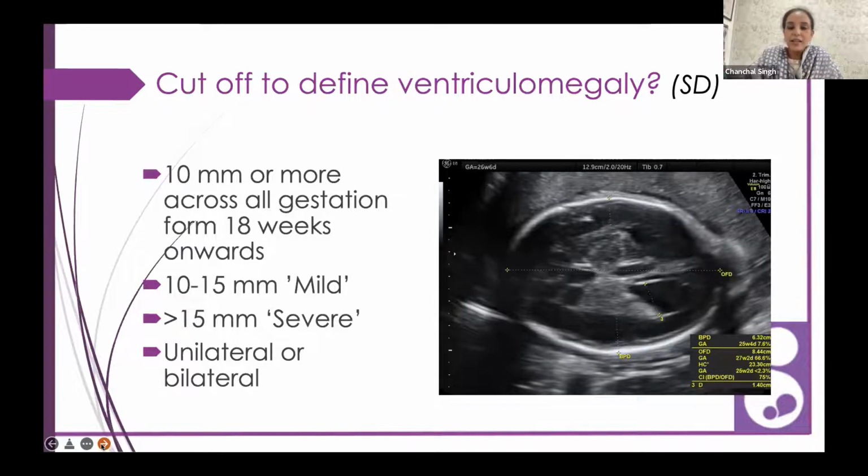All the panelists can intervene, and please stop me if Dr. Prashant, you have a different point of view. In our antenatal literature, the ventriculomegaly or the asymmetry starts mattering only when there is ventriculomegaly, not otherwise. Okay, so if one is 7 and the other one is, suppose, 3, then we should not worry.